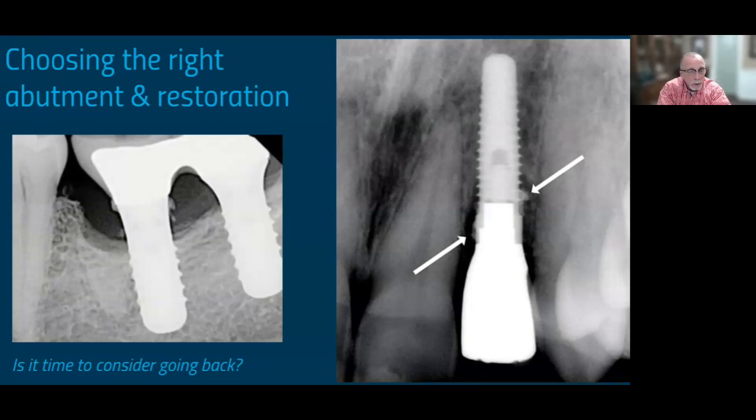And then a few short years later, this started to rear its ugly head, right? With the excess cement that you see here, we started seeing rapid and massive bone loss because of little flecks of cement that we just couldn't see and just didn't get cleaned out well. And now we have this term that we didn't have 15 years ago called periimplantitis, which is the name for what we're looking at here. So if you go ask lab guys today what percentage of your implant crowns are cemented and what percentage are screw retained, you're going to hear a complete reversal again. And now we're back in the 90th percentile of our crowns being screw retained because of what you see in these pictures. Nobody wants to deal with this.